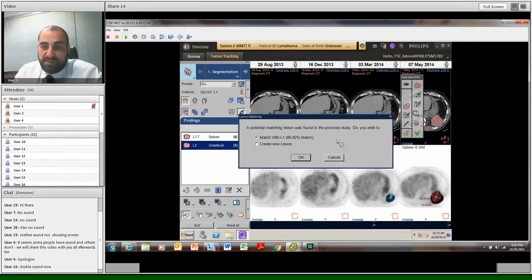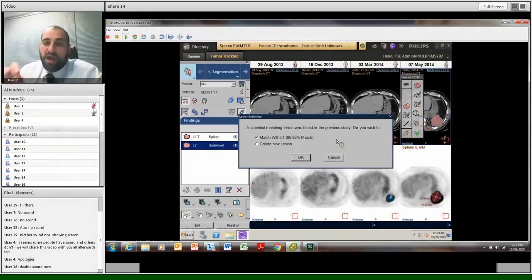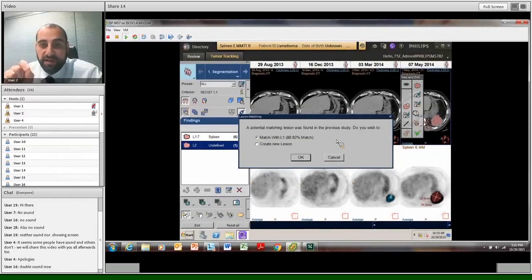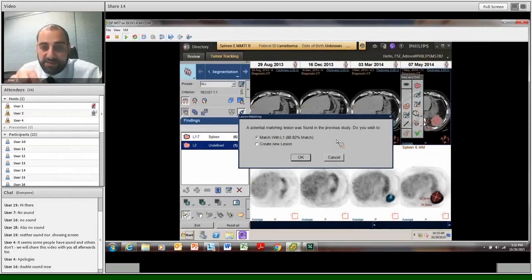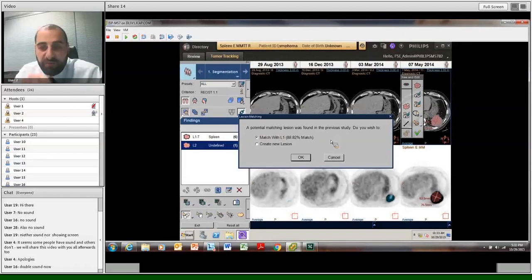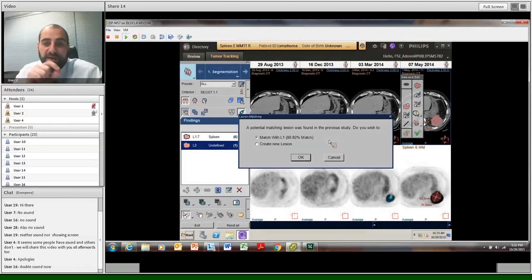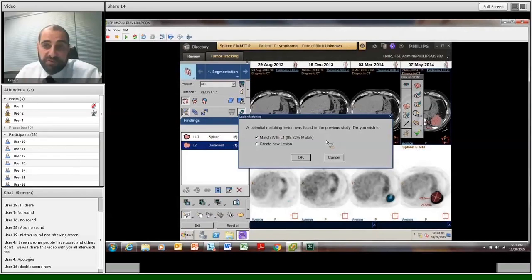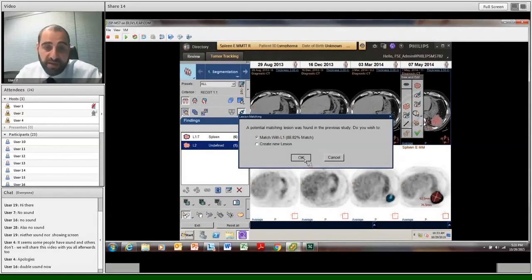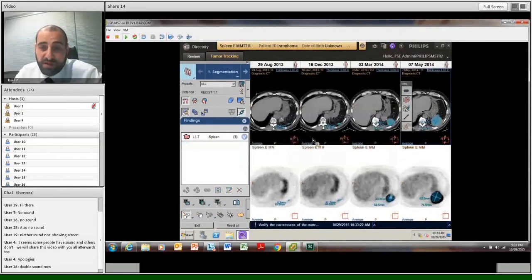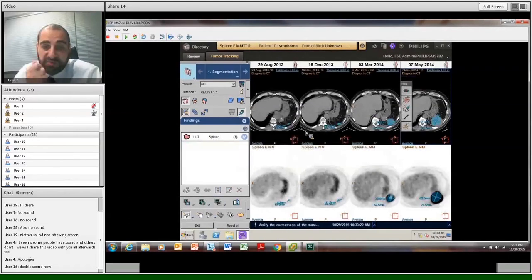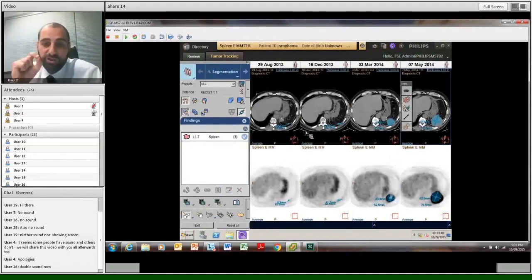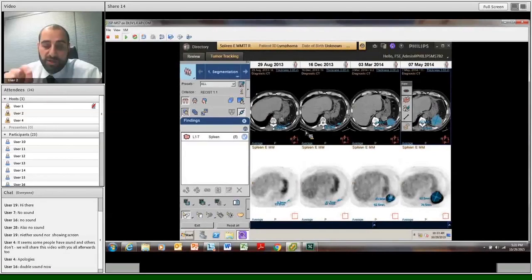If you have a look at the image in the last box at the top row of CT scans on the 7th of May, you see that the large lesion there posteriorly has not been selected. We can easily just click onto this button, as you can see there, and we can select this lesion. By pressing control, just as simple as that, we can increase it significantly to capture the entire tumor border. And automatically, it will go there and go back and correlate with the PET.